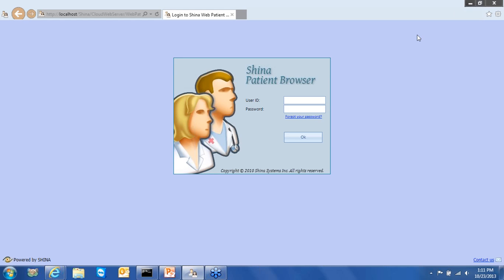So when a physician wants to address his or her work list, obviously for HIPAA compliance, there's a login required. And this login is specific to the user, not specific to a workstation. And as I log in and address my studies, there's a complete audit trail that goes on behind the scenes, again, to match the patient privacy and the HIPAA compliance for who touches what study and what's been done to it.